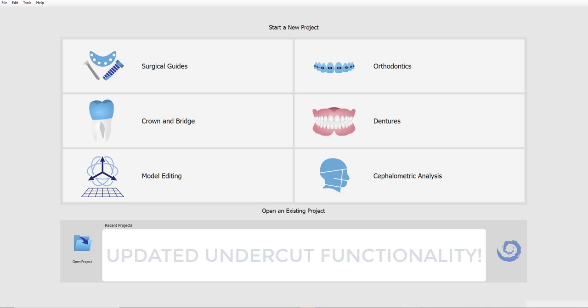In older releases, the path of insertion was set to zero, meaning the undercuts were removed perfectly perpendicular to the horizontal base of the model, and there was no option to change that. In the previous release, we changed the default to be 30 degrees, and we allowed the user to customize the path of insertion on a per case situation.